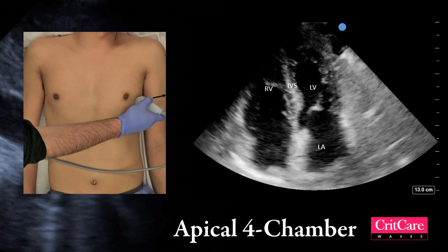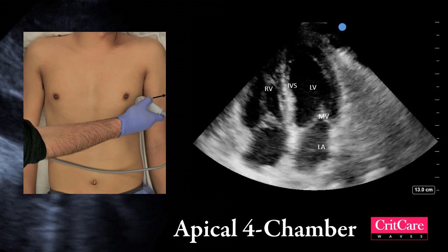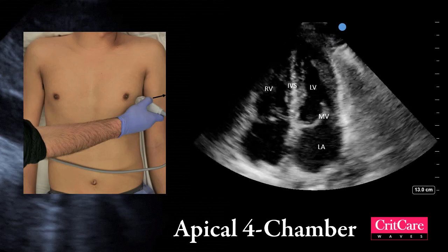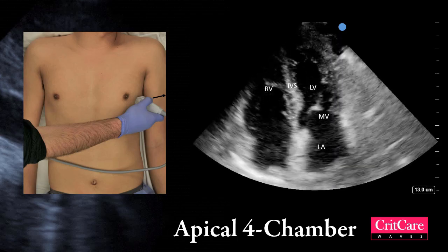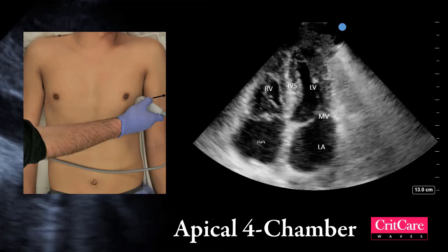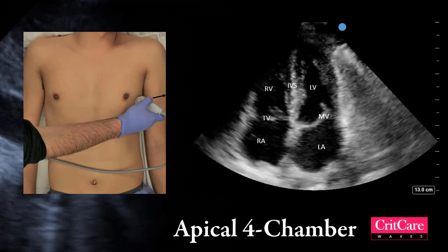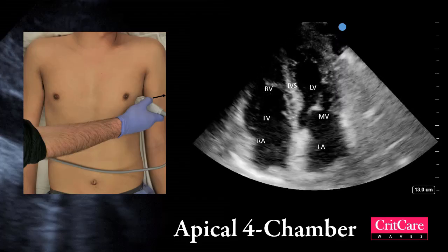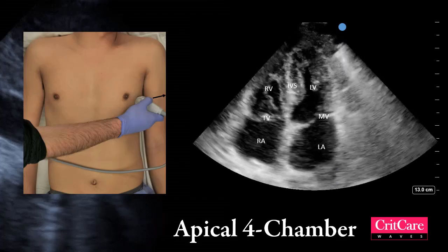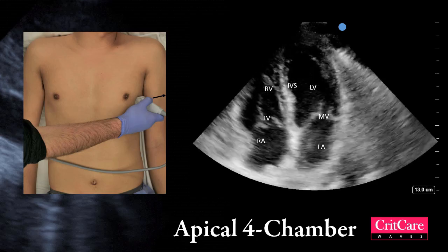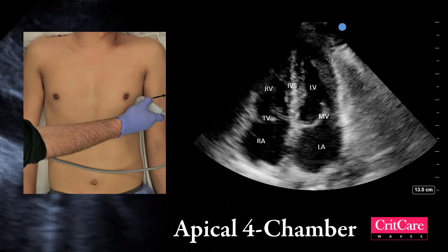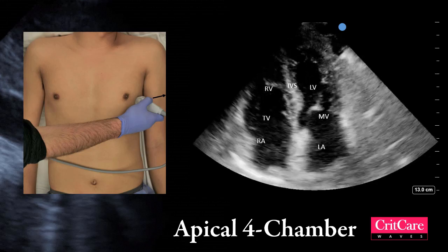Here is the left atrium and the mitral valve between the left atrium and ventricle. The right atrium is adjacent to the left atrium, and the tricuspid valve is between the right atrium and ventricle.